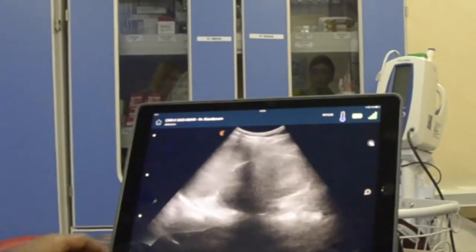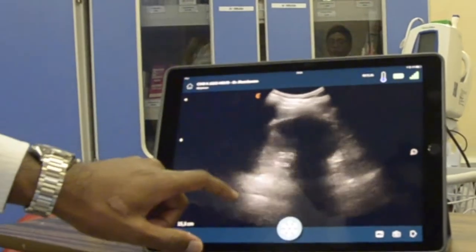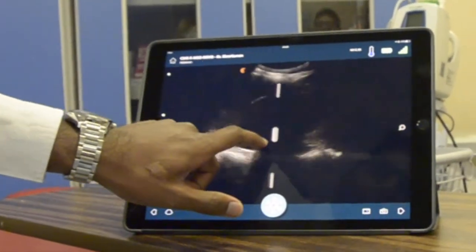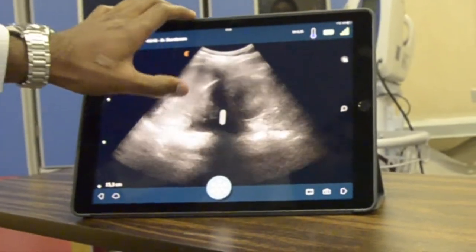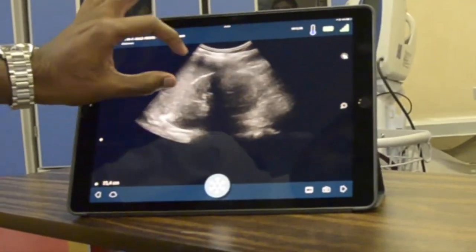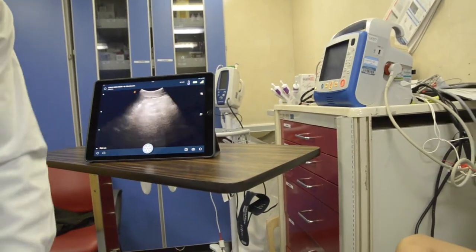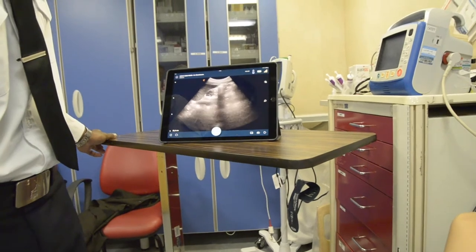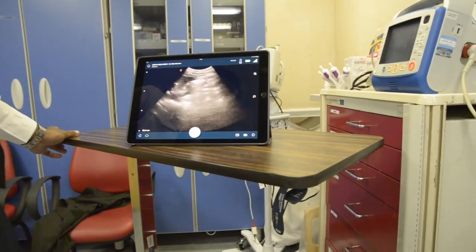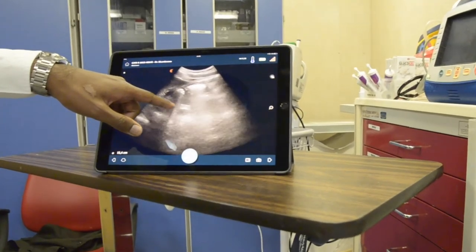Now we're going to look at the spleen. Here we have the spleen and the kidney. You can adjust the gain automatically — make it bigger, brighter, whatever you want — or back to automatic. We can zoom in and zoom out, and we can look at the aorta. Looking for the aorta — there it is. There's the aorta and there's the superior mesenteric artery coming off there.